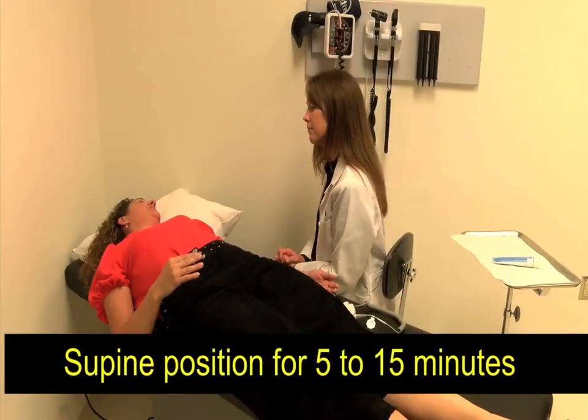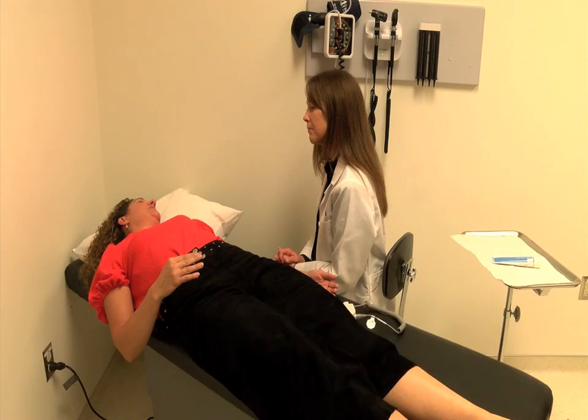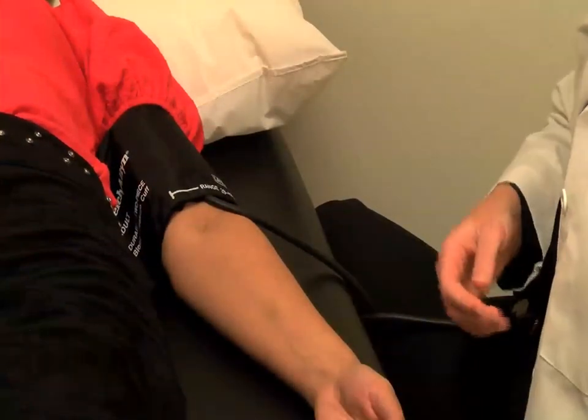To begin the assessment, your patient should be lying in the supine position for approximately 5 to 15 minutes before the examination. This allows the blood pressure to normalize for the most accurate readings. Ideally, patients will not have used tobacco products for 30 to 60 minutes before the exam. Once your patient is lying supine, relaxed, and has consented to the screening test, we can begin our blood pressure assessment. To determine the brachial systolic blood pressure, use the handheld vascular Doppler.